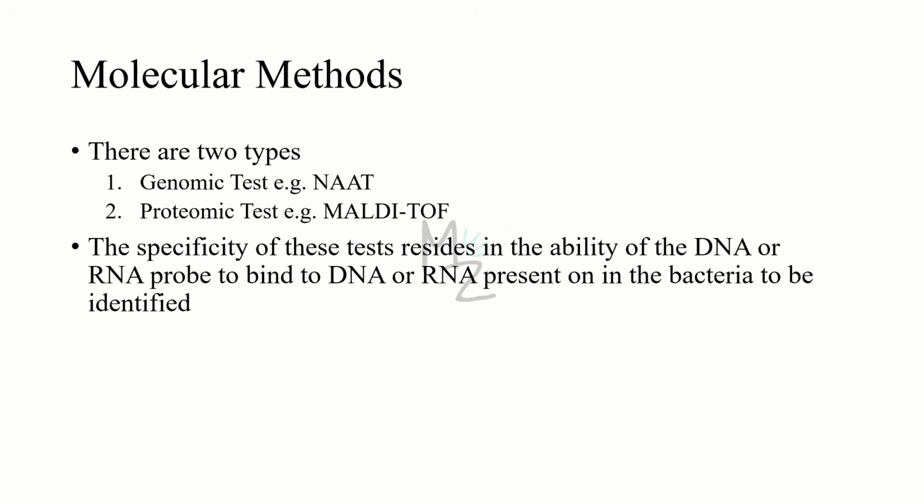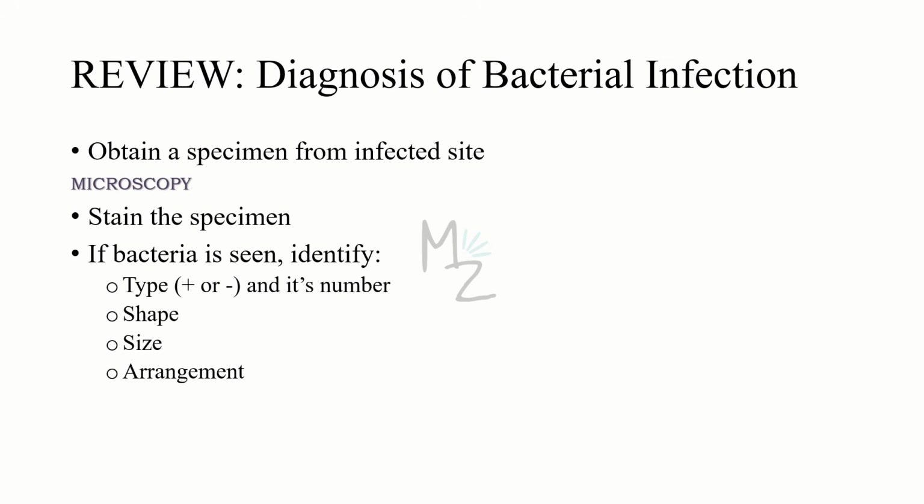The specificity of these tests resides in the ability of the DNA or RNA probe to bind to DNA or RNA present only in the bacteria to be identified. I know it was too much knowledge in today's video, so I'm going to review that by summarizing it here.